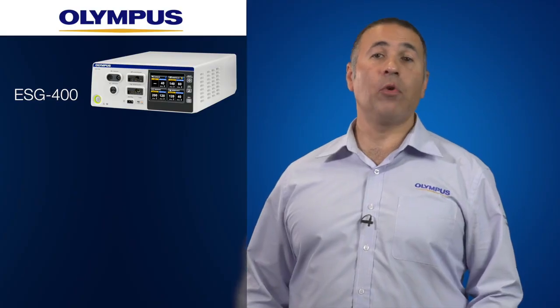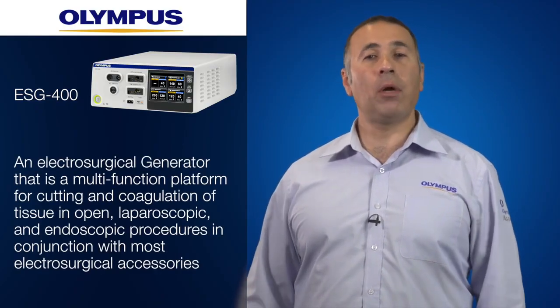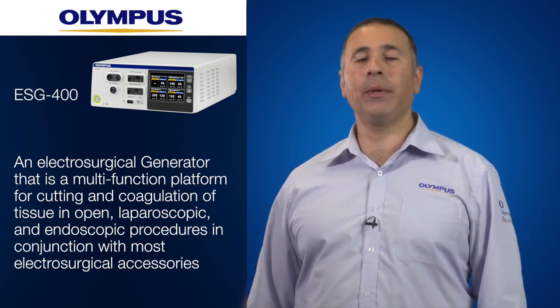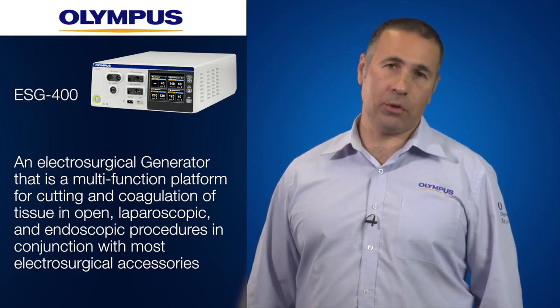In providing an overview of the ESG400, we introduce it as an electrosurgical generator that is a multi-function platform for cutting and coagulation of tissue in open, laparoscopic and endoscopic procedures in conjunction with most electrosurgical accessories.